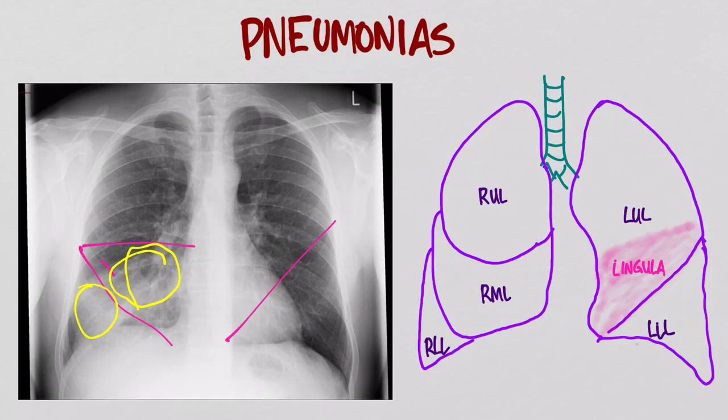So this was a quick tour looking through how to look at pneumonias on chest x-rays. You should have some practice ones to do. And if you have any questions, please feel free to ask.